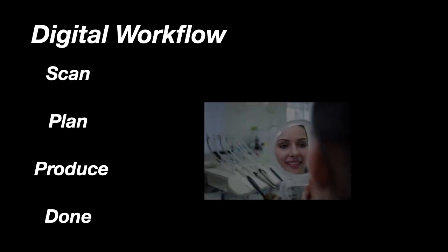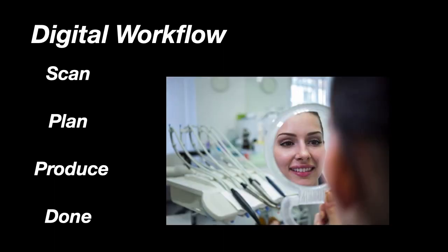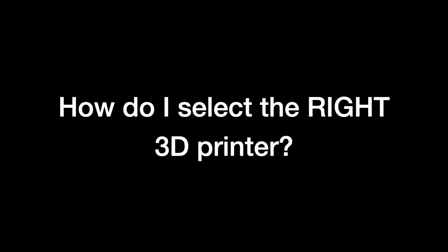And then subsequently, the tooth or the restoration is delivered to the patient. So this is in short the digital workflow. So that brings me to a next question that I get asked quite often: how do I select the right printer? Now, there are a lot of things that do go into this.